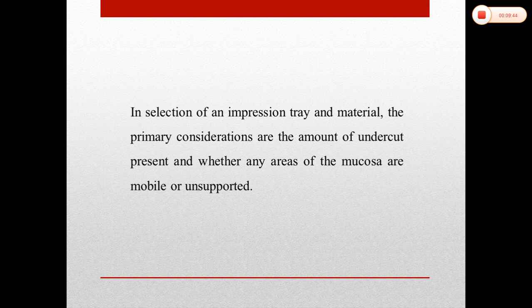So when you have an undercut area, the impression tray we have fabricated will not move into the oral cavity, and it might be difficult for the clinician to place or remove the special tray. So for patients who have undercuts, they have to be relieved or blocked out first, and then we fabricate a special tray according to that condition.